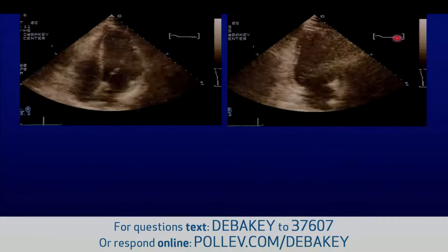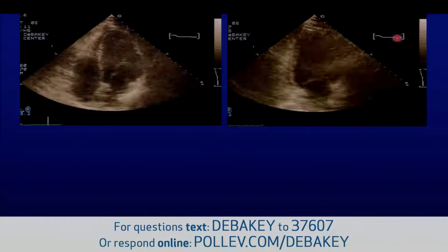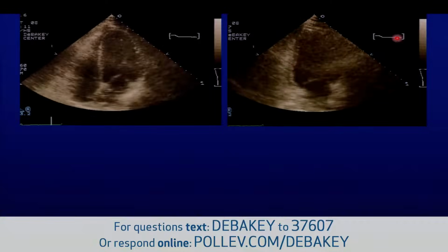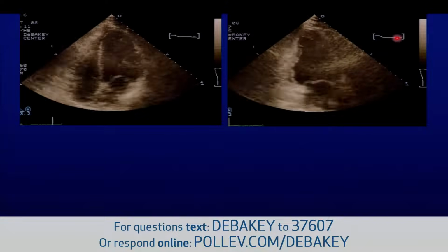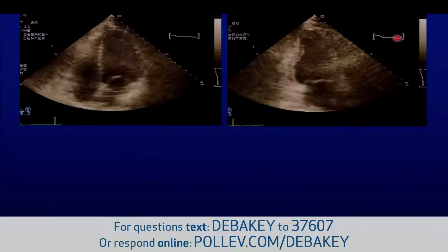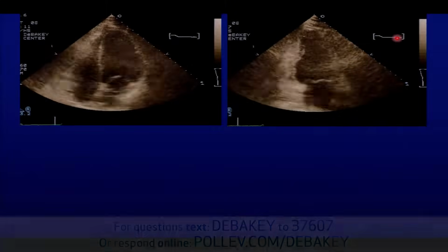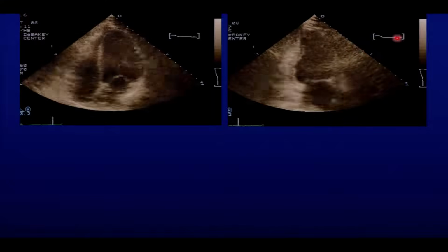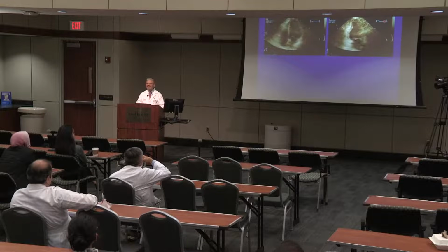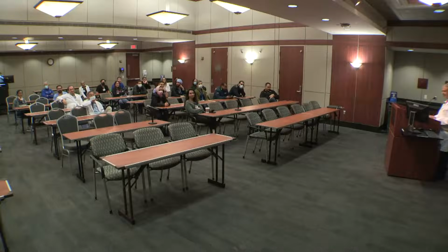All right. Take a look at this case and tell me what you think. How are you going to interpret this case? Anybody, and you don't have to use the microphone, I'll repeat your answer. All right, anybody? Oh, come on. Basal anterior, inferior, yes.